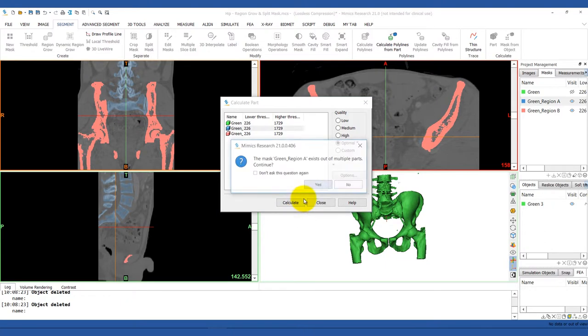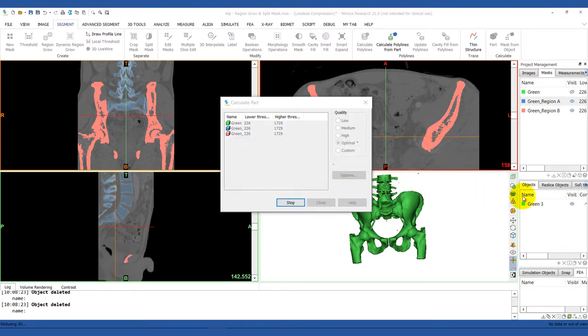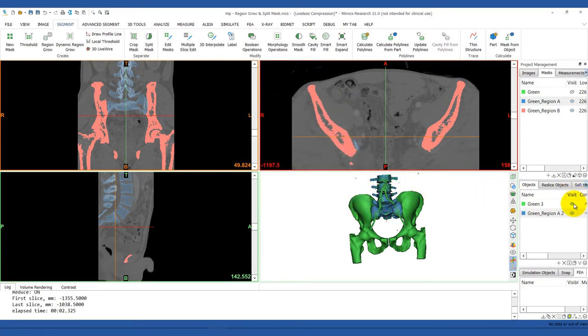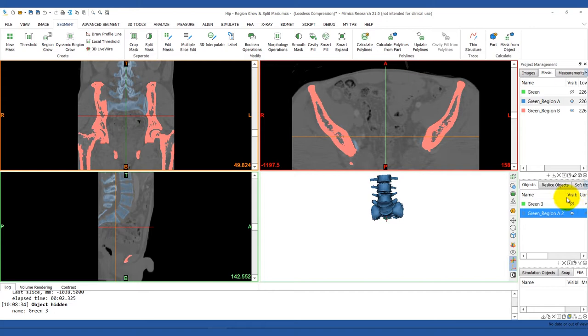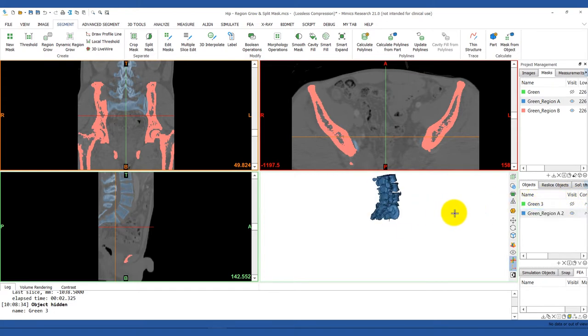You can see that this creates two new masks, which we can visualize in 3D. That's all.